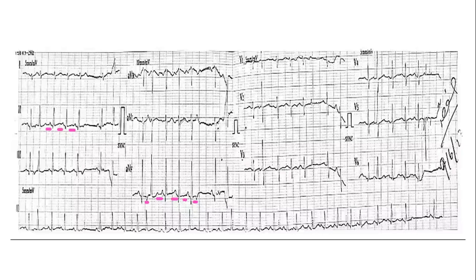Obviously we are seeing these ECGs. So you are right — he's having atrial ectopics. These are ectopics. And when these happen there is irregularity. You see that over here — this came and the R came earlier. Over here this came, there was a pause.